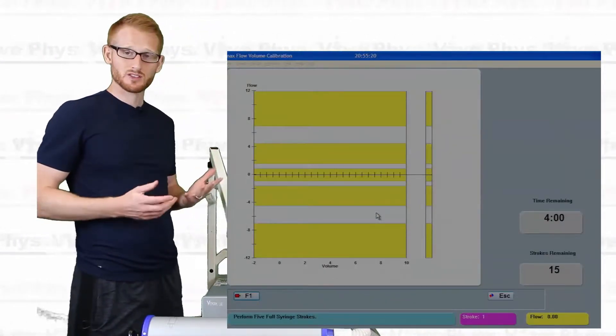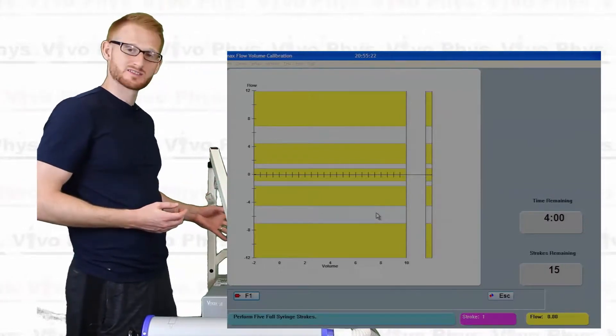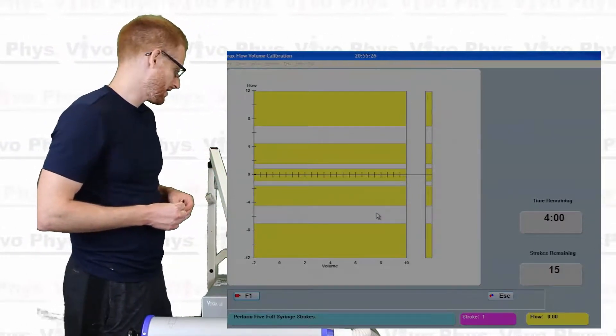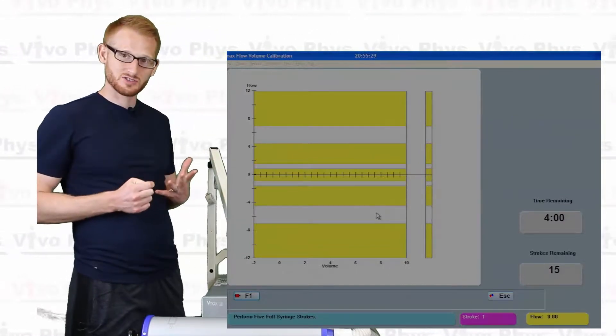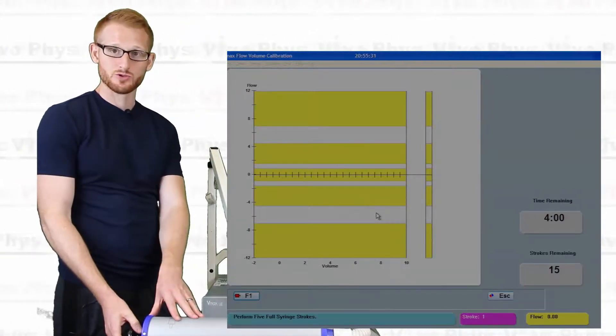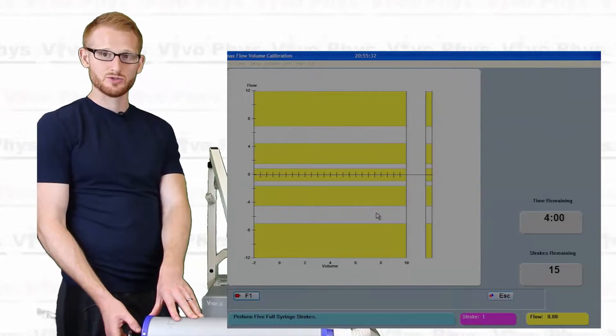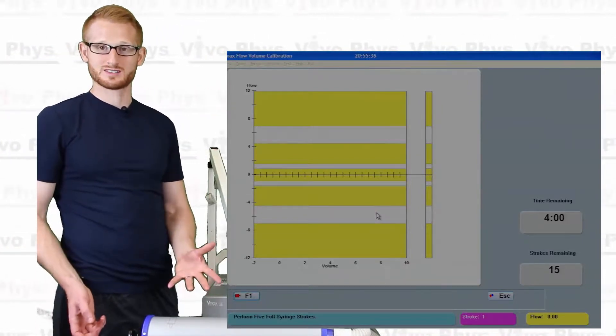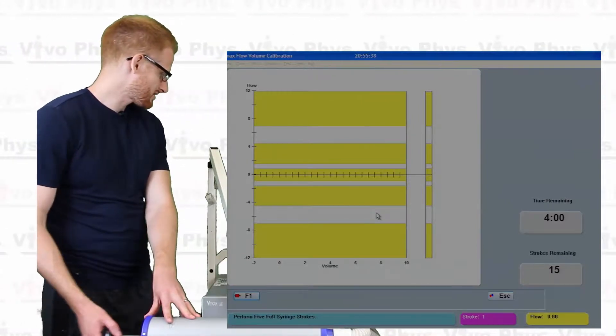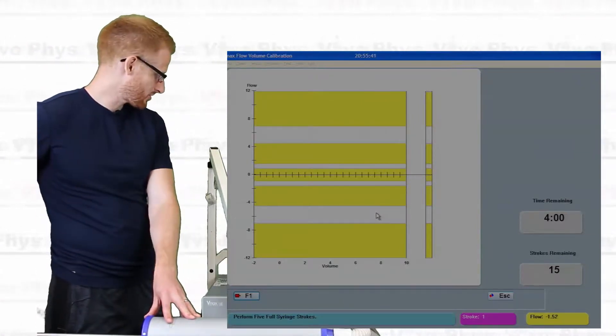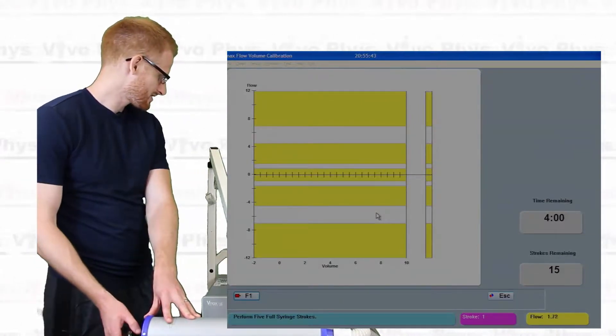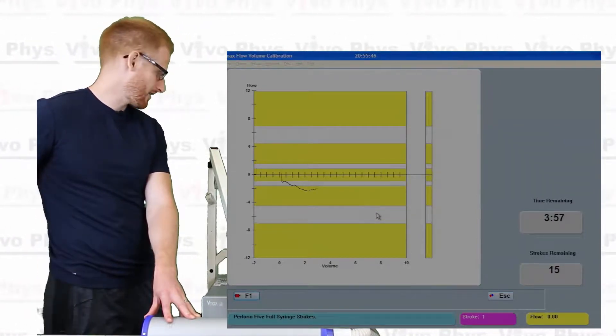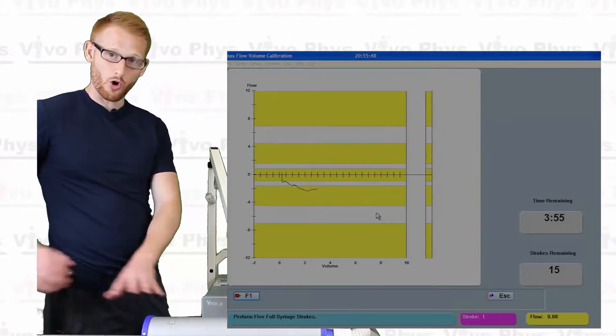Alright, so once it gets all the way across that little green bar, that is when the system has decided there has been zero flow for long enough that it has sort of a baseline for flow. Alright, so we're past that now. And we see this window with all these yellow bars. And what it really wants us to do now is we're going to start using this syringe to plunge air into the system at set rates. Alright, so you'll see once I start going here. So it takes a couple strokes for it to really see.